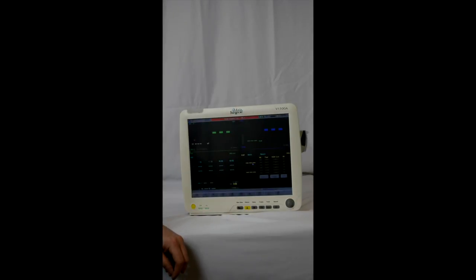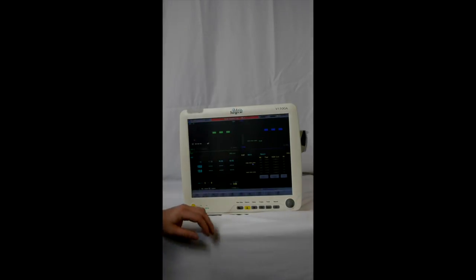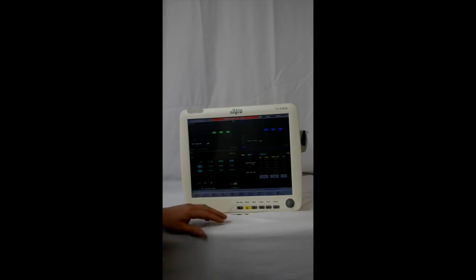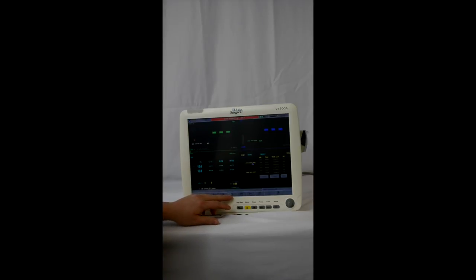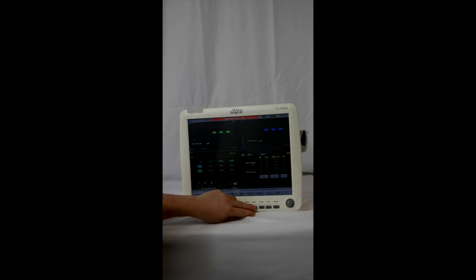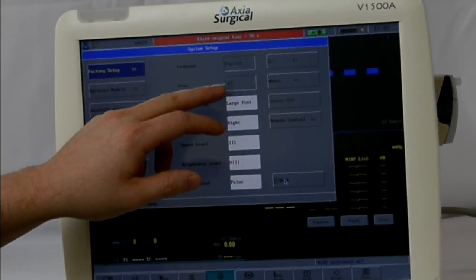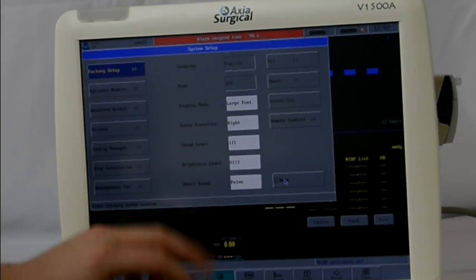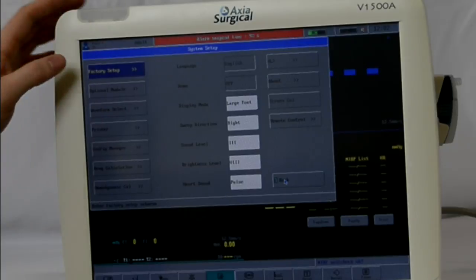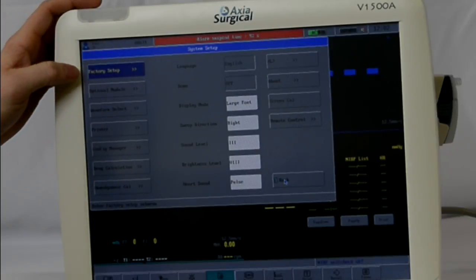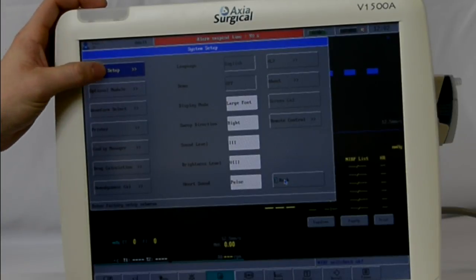To access the demo mode on your Axia monitor, you can either press the setup key on the monitor or the button at the bottom. When you press it, you're going to see the demo is grayed and that it's off. Press the factory setup at the top left corner in blue.